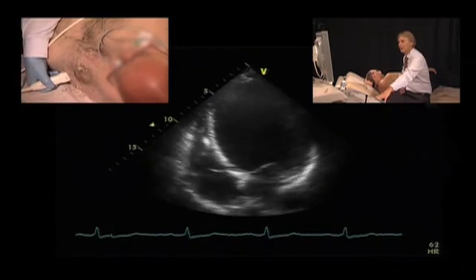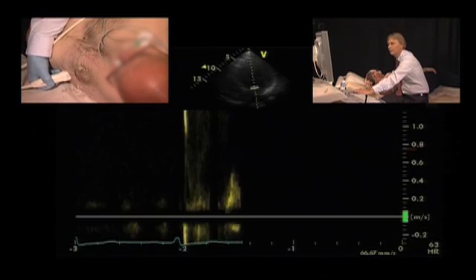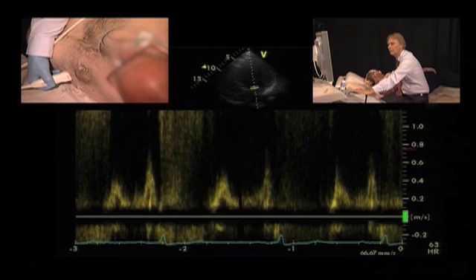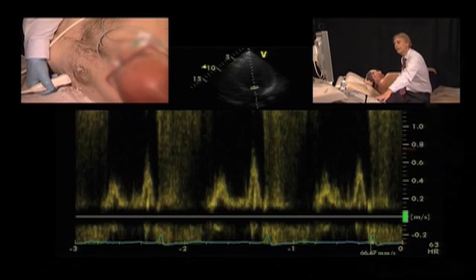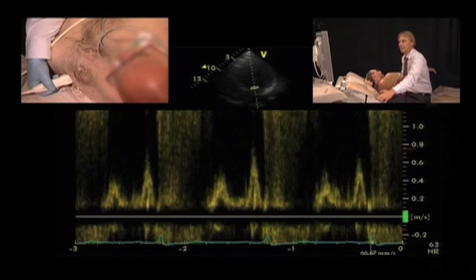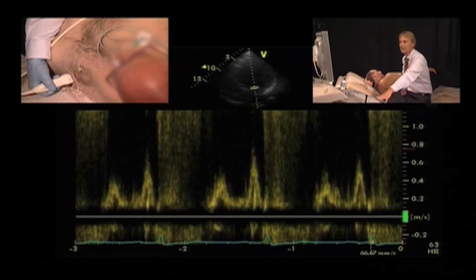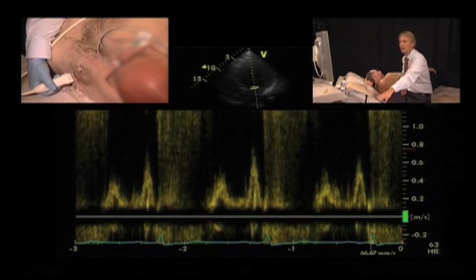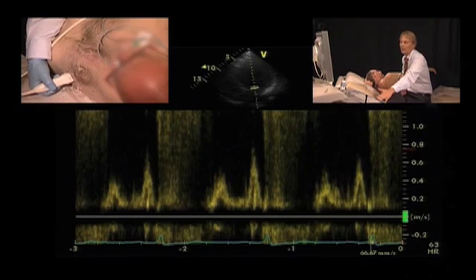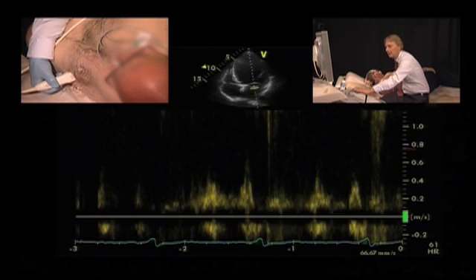Now let's turn to diastolic function. The diastolic function in this patient can be assessed with the help of pulsed-wave Doppler. What we see is that the A wave is taller than the E wave, so we have impaired relaxation. This is an important finding, especially in this setting, because it shows that the left atrial filling pressures are probably not very high. We also performed E to E prime calculations using tissue Doppler, and there we found an E to E prime ratio of something in the range of 9 to 11, which is indicative of fairly normal or at least mildly elevated left atrial filling pressures.